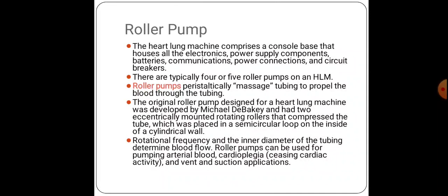There will be a cylindrical wall, and in it there are two rollers. The two rollers press the tube. By pressing the tube, the blood from that pressed place is moved to the other parts. So this is the principle of the roller pump.